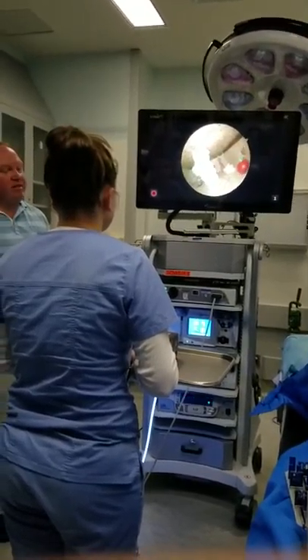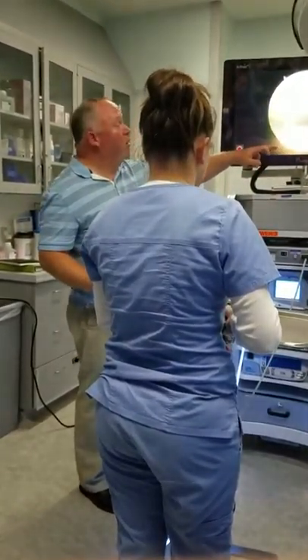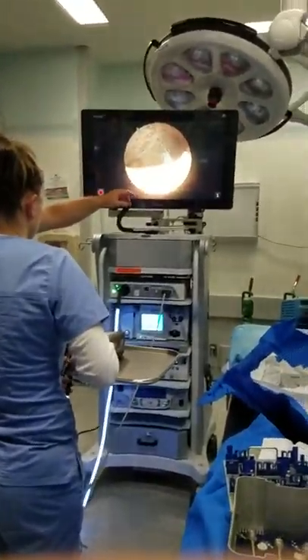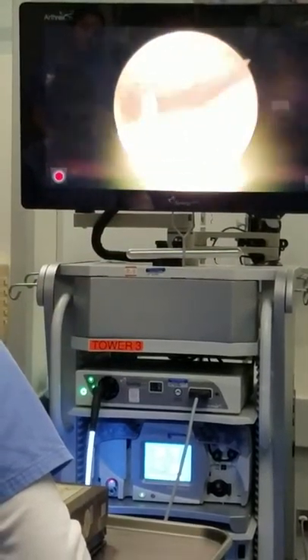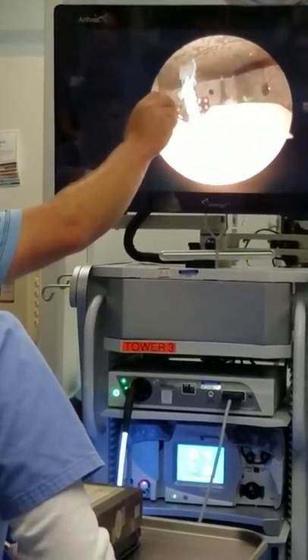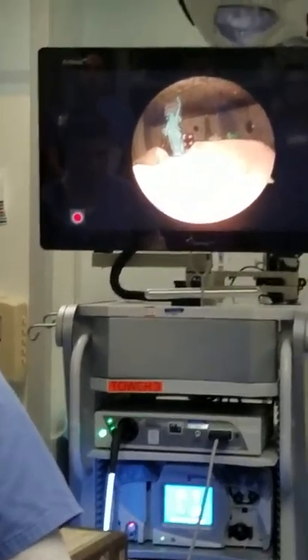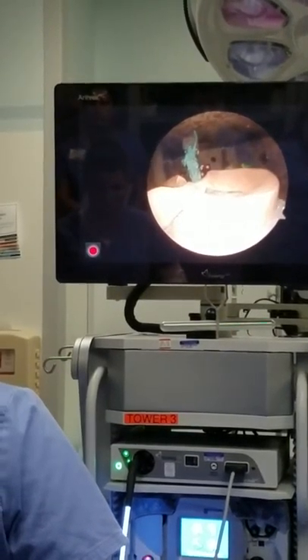So it's supposed to kind of represent somewhat what a knee would look like. So when you come in, you're going to see a meniscus. Obviously, I would have a whole knee here, but you have a meniscus, and then you kind of come over top. And so when the doctor's too low, that's the view they're going to see. So when they want to get a view like that, you look at the meniscus. Then if it's frayed away, they're going to take a shaver there on the other side of the kneecap.